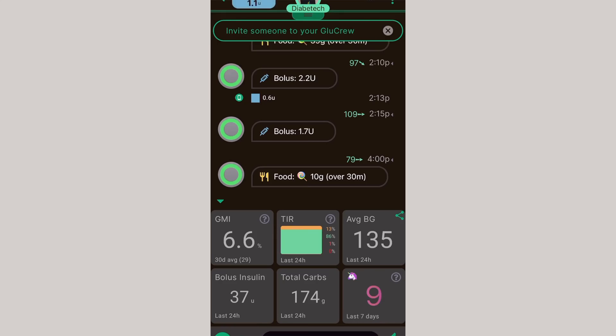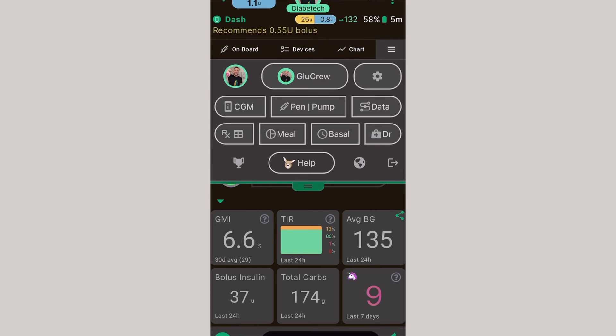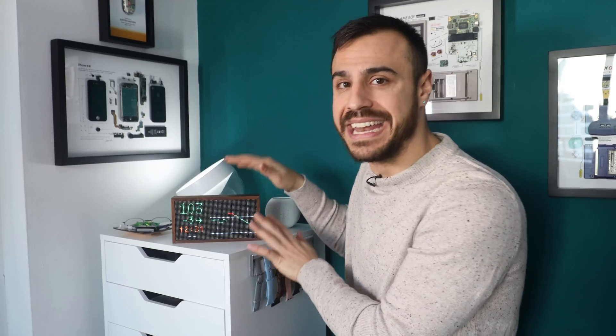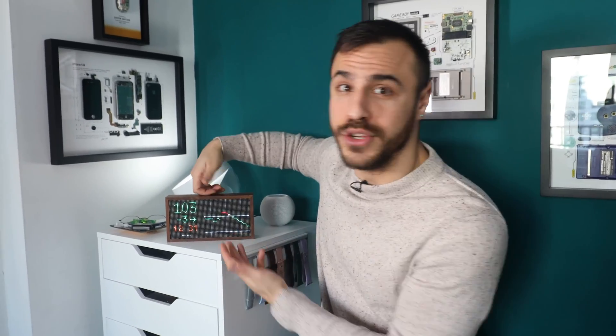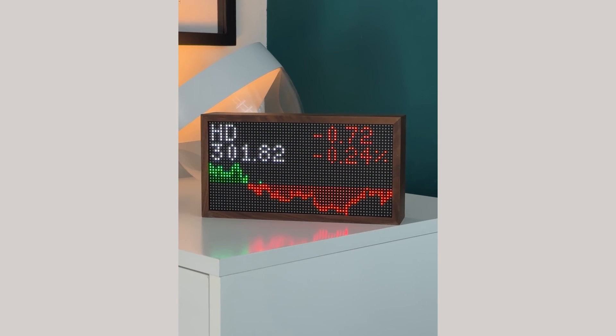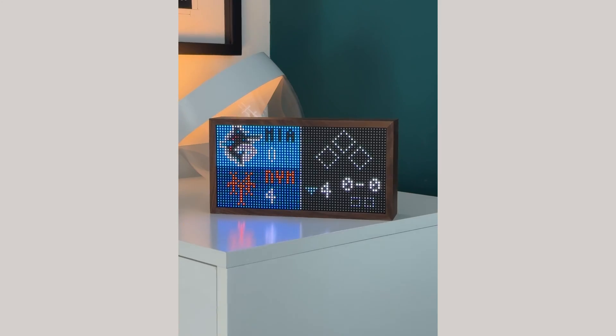Connecting your CGM information to Tidbit is a little more involved than the Sugar Pixel. What I used was an app called Gluru. With the Gluru app, once you connect your CGM using either your Dexcom account or your LibreLinkUp account, it will give you a Nightscout link. With that Nightscout link, you can plug it into the Tidbit app and your sugar levels will automatically connect to the Nightscout app. You can also have other fun apps rotate through and even schedule them, so your blood sugar levels only come on at a certain time of day. There's also a cool night mode where it goes completely grayscale for a cleaner, less bright look.